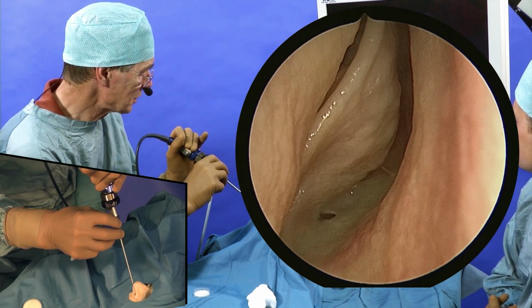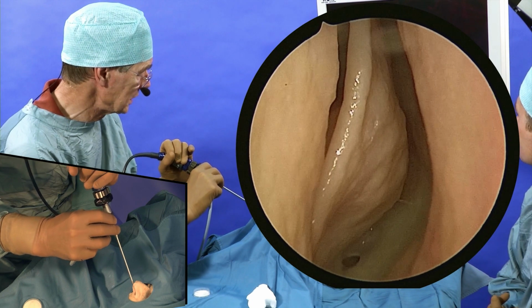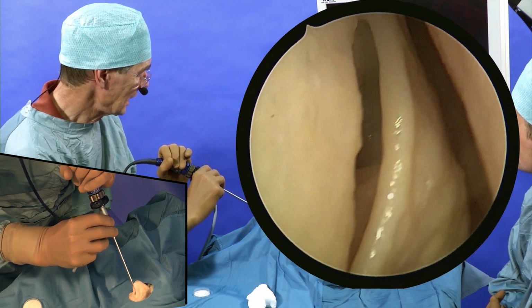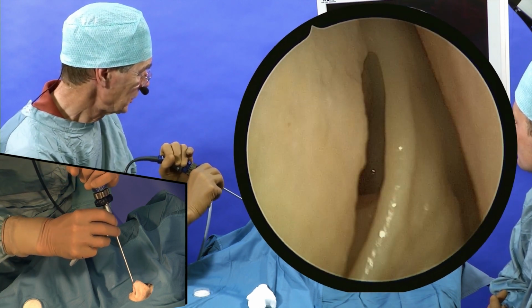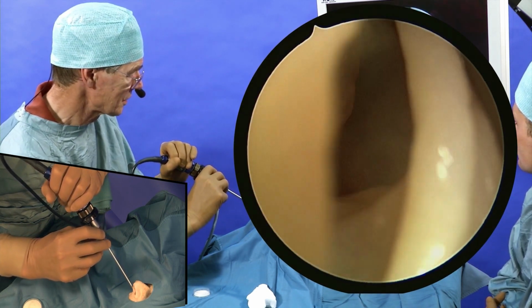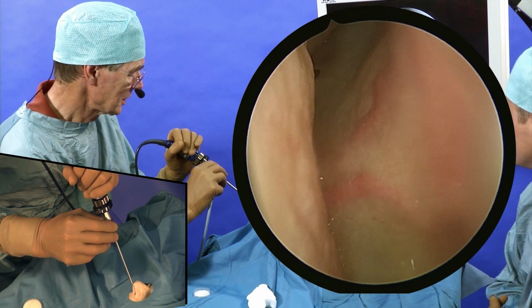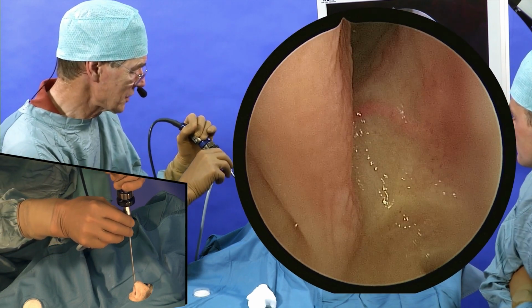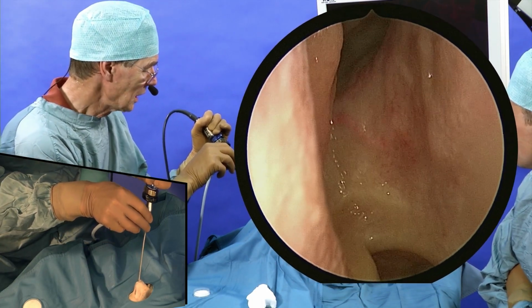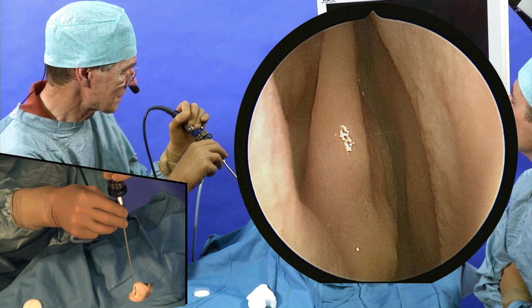You can see the superior turbinate. And if I try to look into that gap over here between middle and superior turbinate, let's take advantage of the angulation. We can have a look here into the posterior ethmoid, the superior meatus, that is. And again, we'll move out of this, over the sphenoid ostium, etc. You see that I need two hands to stabilize camera and endoscope alignment and to rotate the tip of the lens. So there we go.